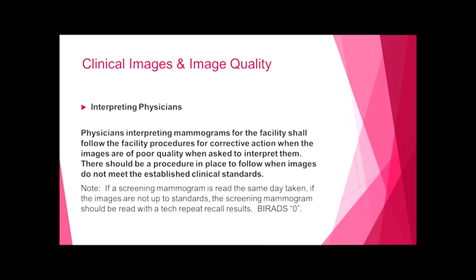So, clinical images and image quality: the interpreting physicians shall follow the facility procedures for corrective action if you end up in a situation like that, when the images are poor quality when asked to interpret them. There should be a procedure in place to follow when images do not meet the established clinical standards.